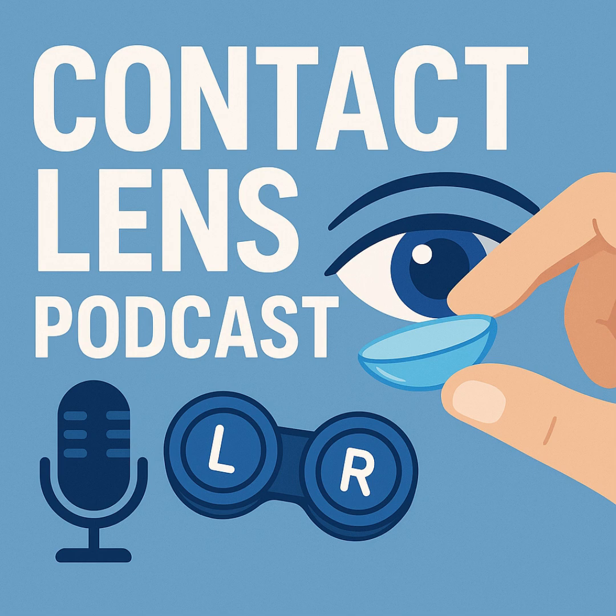Makes sense. What about the other common ones, the 2-week or monthly lenses? They're often cheaper. They generally are more cost-effective up front, yeah. The trade-off is the discipline. You have to clean and store them properly every single night. And even then? Even with great cleaning, some buildup over 2 weeks or a month is kind of inevitable. Some people definitely notice their comfort level drops off near the end of the wearing cycle compared to that fresh, daily lens feeling.